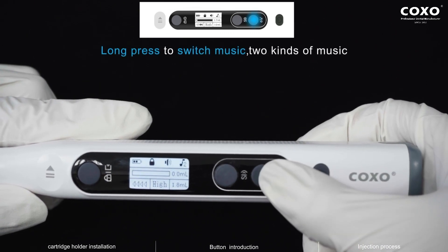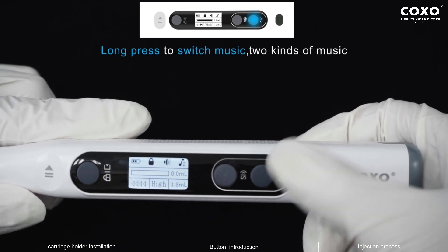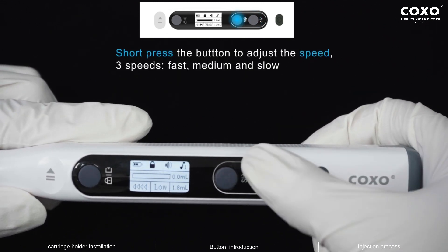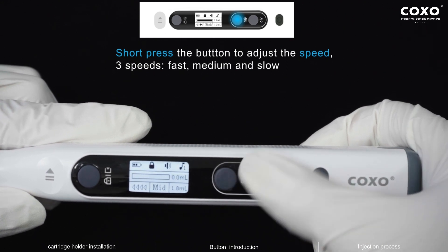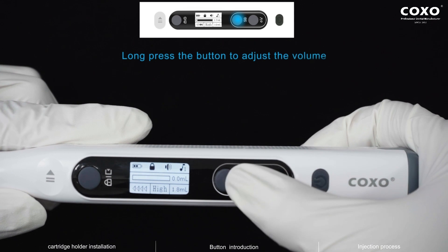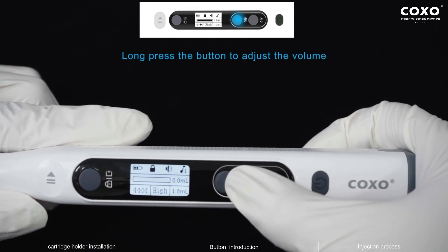Long press to switch between kinds of music. Short press the button to adjust the speed — three speeds: fast, medium, and slow. Long press the button to adjust the volume.